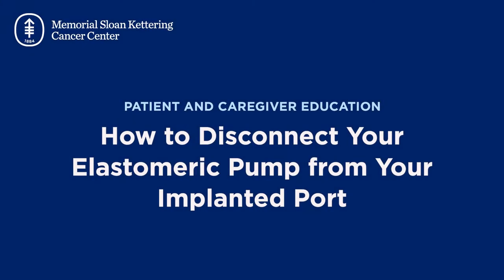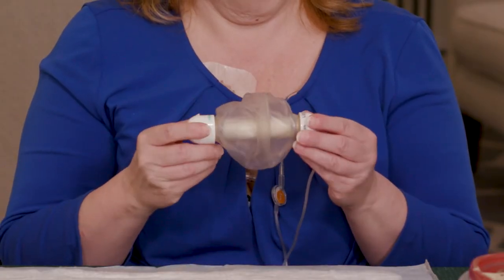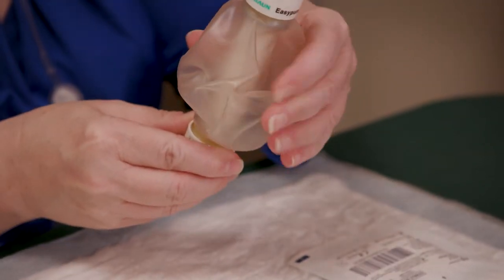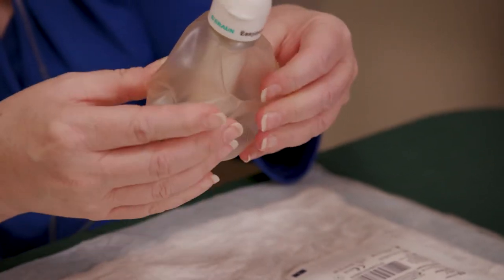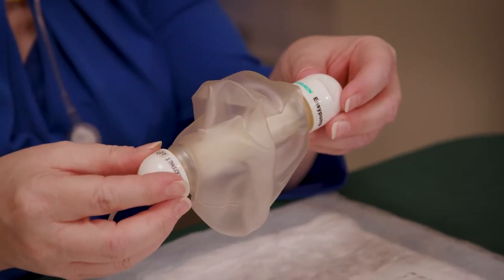In this video, we'll show you how to disconnect your elastomeric pump chemotherapy bottle from your implanted port. Before you start, check your elastomeric pump to make sure the inner balloon is deflated and the outer cover is wrinkled. If they aren't, don't disconnect your pump — your chemotherapy isn't done infusing. Call your health care provider.